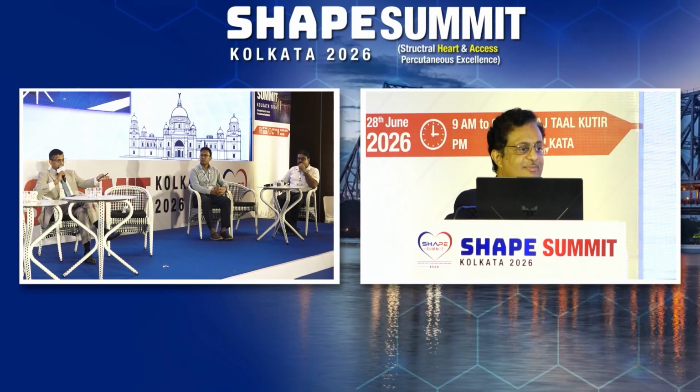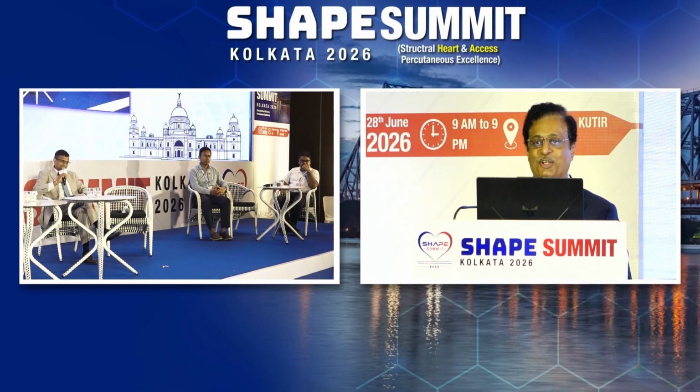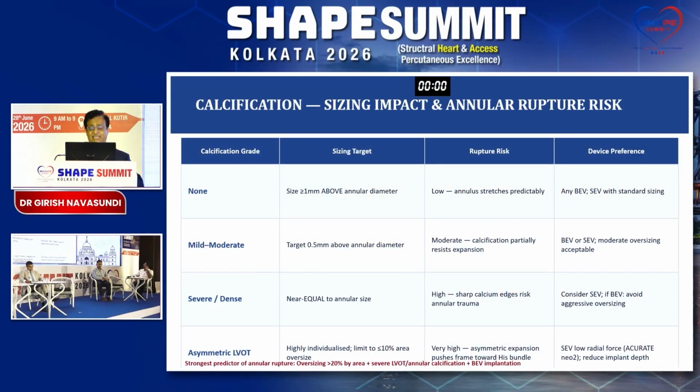I think you can show this slide because it seems to be more important than anything. That is why you stopped over there. I know there are certain things that you must see to understand. When you have calcification, I think this is one of the most important things because you never want to have a rupture. If there is none, use at least 1 millimeter and above; mild to moderate, upsize by 0.5. If it's severe and dense, you may have to go by nominal or slightly less.